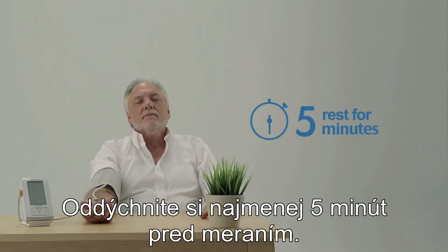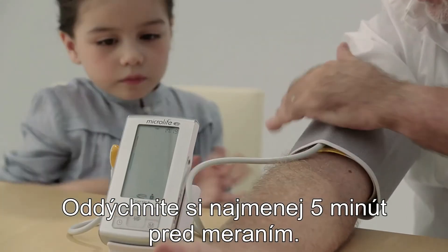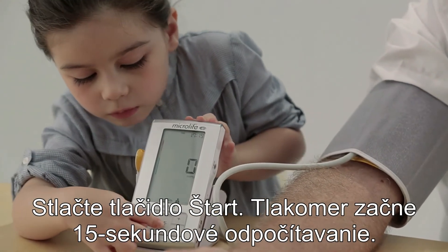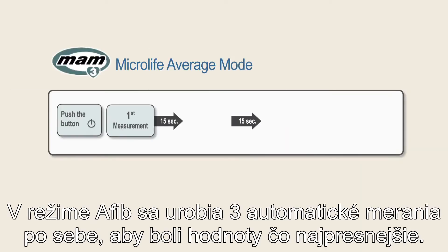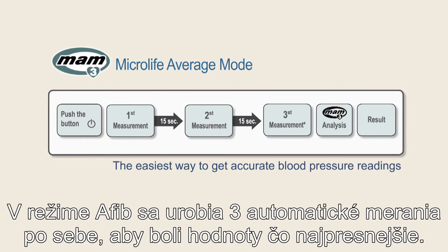Relax for at least five minutes prior to the measurement. Press the start button. The device will initiate a 15-second countdown. In Afib mode, three consecutive measurements are automatically performed to get accurate blood pressure readings.